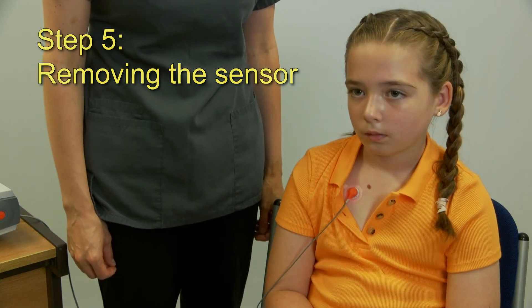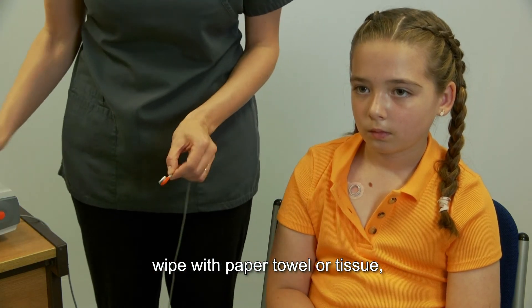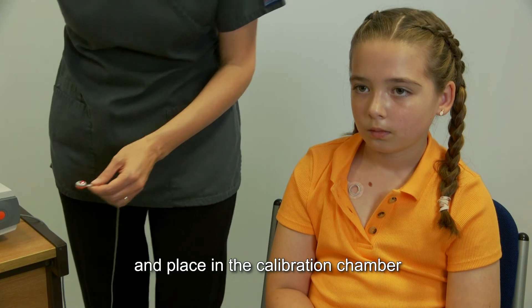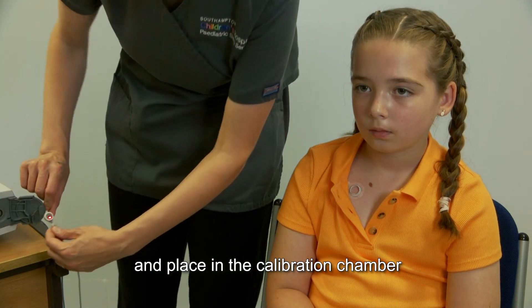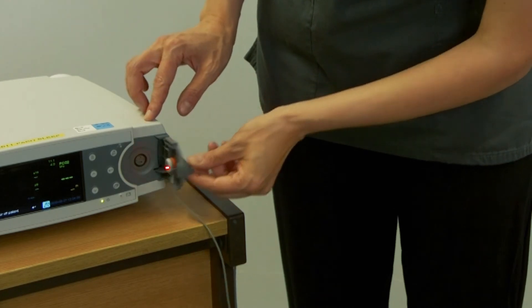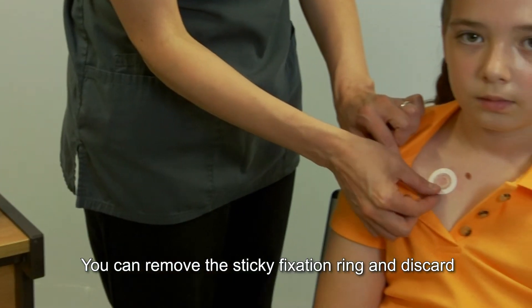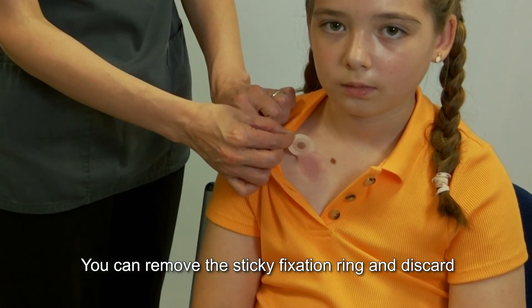Step 5: Removing the sensor. When your child wakes in the morning, remove the sensor. Wipe with a paper towel or tissue and place back in the calibration chamber. Make sure the red light is facing inwards — if this is not done, the sensor may dry out and not work the following day. You can remove the sticky fixation ring and discard.